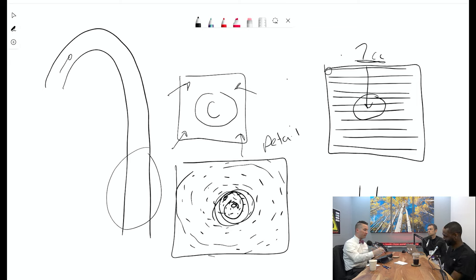I need to make sure that the entire thing is opacified, and you obviously have the patient take in a breath and hold it. You want them holding their breath and have the complete thing opacified before you hit go. For sure. And the importance of the breath hold is pretty much the accuracy of the positioning. For a thoracic aorta or a renal artery, it's just motion.